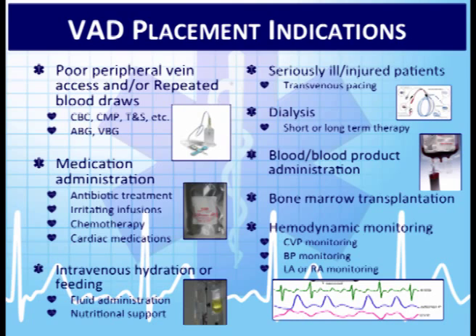Irritating infusions: potassium has to be run very slow, for example, through a peripheral line. It burns, it's irritating to the veins. You might have had it before. So if we have to run it a little bit faster because the patient's pretty sick, it has to go through a central line. Even our dopamine in the field, they do not like running that in a peripheral line in the hospital. They really like to transfer that device, any of those vasopressors, over into a central line if they're able to. Chemotherapy: patients get chemotherapy, so we'll talk about med ports.